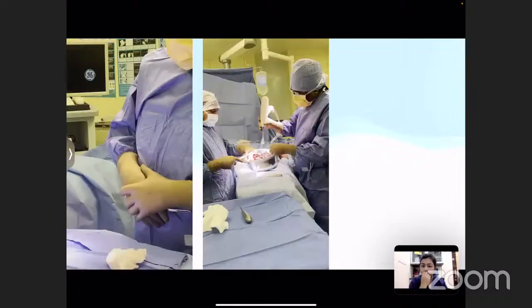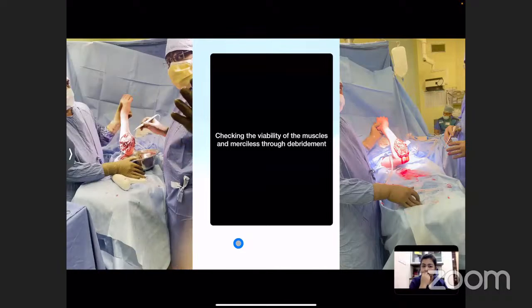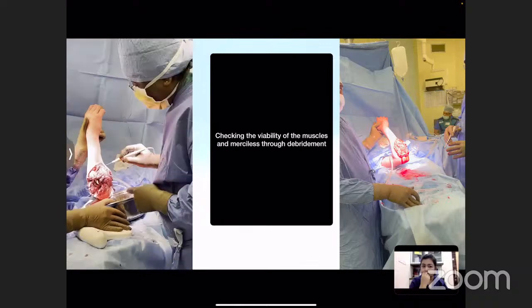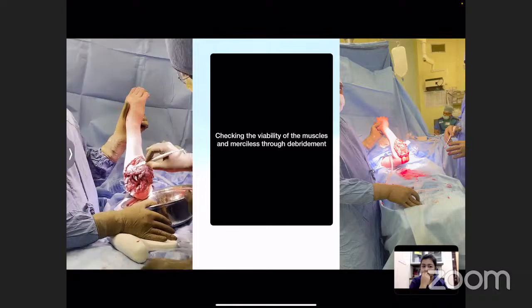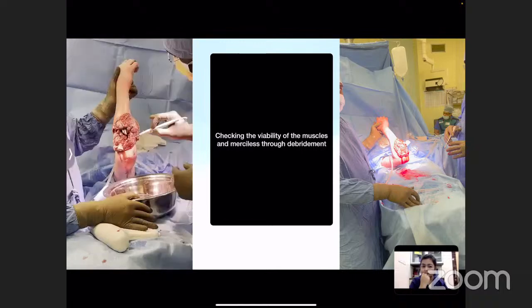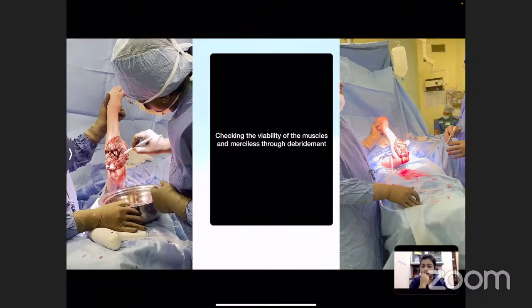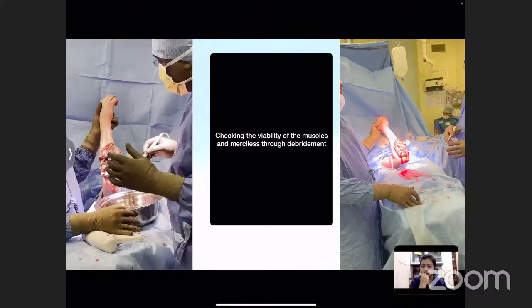We are doing a very complex procedure, and this is a very important step. We check the viability of the soft tissue and the muscles. How do we check the viability? Take your diathermy and just touch the muscle tissue. If the muscle contracts, then it is viable. If it is not contracting, then it needs to be completely debrided. Here it's very limited, but here it's okay. You need to debride all the soft tissue out. So it is contracting. I checked all the soft tissues, and the majority of the muscles are okay. We'll see how it goes. This is the best test to check the viability of the muscle.